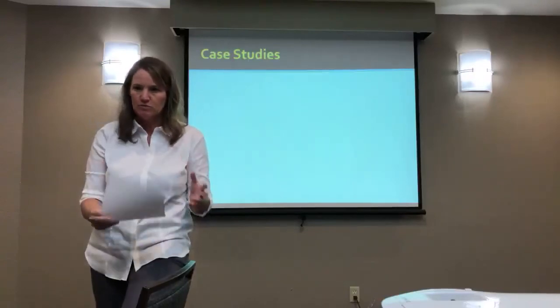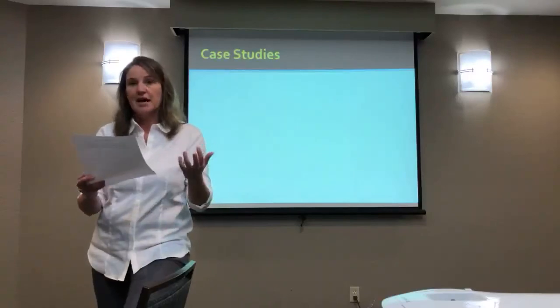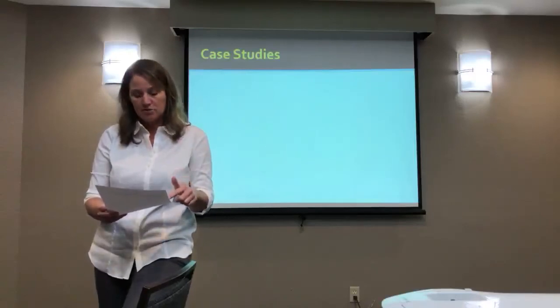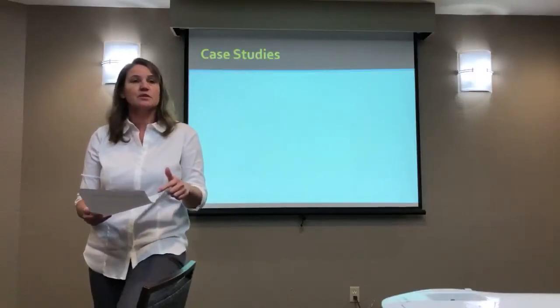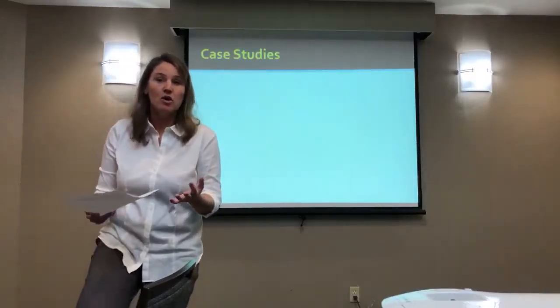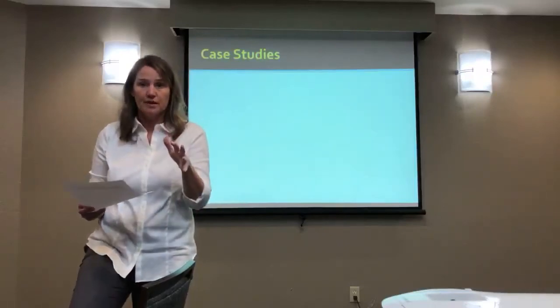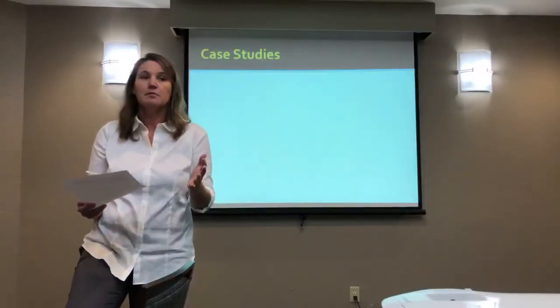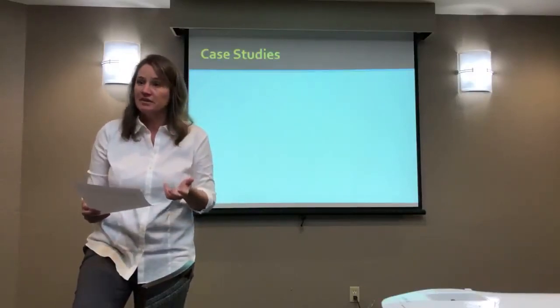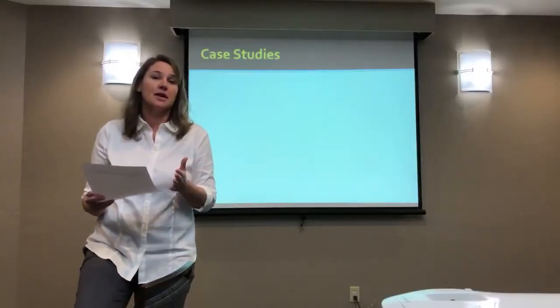This is someone who did do something and they are acutely injured. The idea that ultrasound might help, and I would probably go back and use the exact same argument I used with our knee strain, is I would ask, do they need it? I think we could all argue that no. Is it a necessary component to healing? No. Is it medically necessary? Probably not. That would be a stretch to argue. But could it be of benefit? Again, possibly. So my argument would be the same idea.